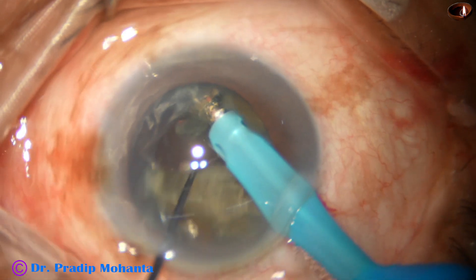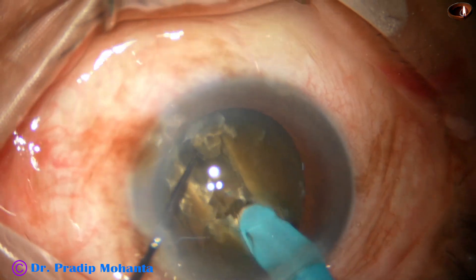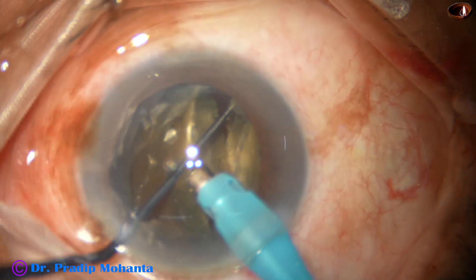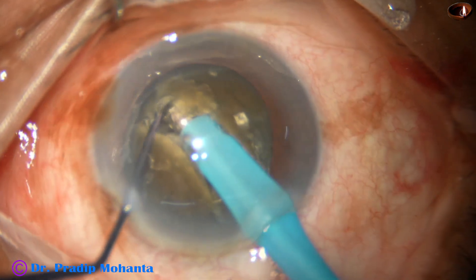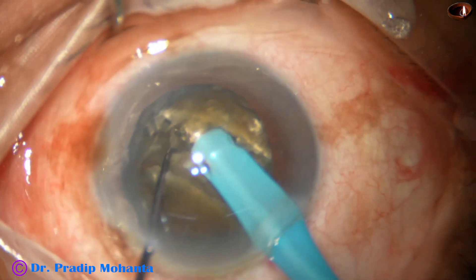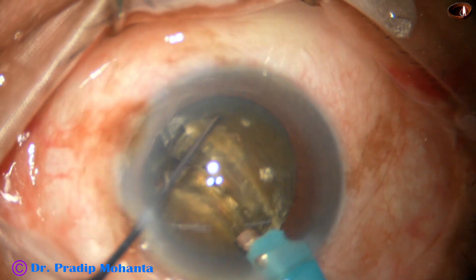Nice crack. We rotate the nucleus — a few more grooves — and rotate the nucleus 80 degrees.